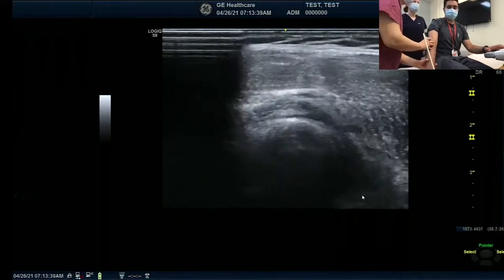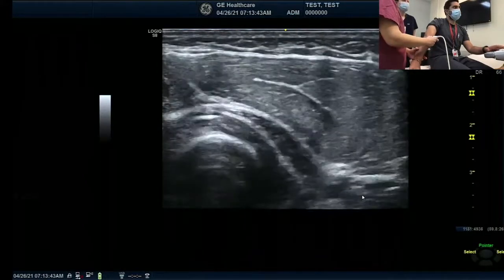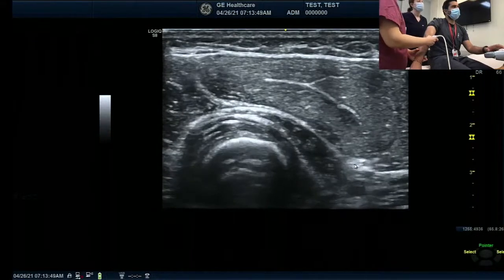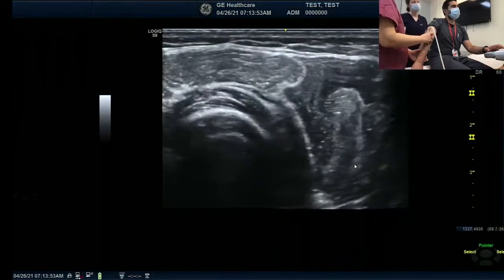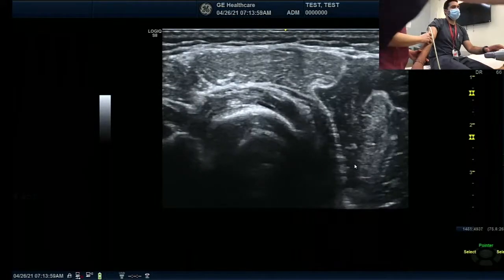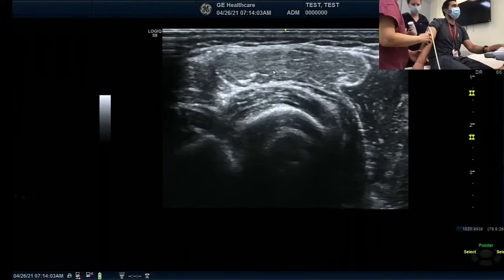Okay. So now I'm going to move the forearm posteriorly. So here, this is the extensor carpi radialis longus, supinator, and radial nerve, right? The branch. And then I'm moving to the posterior part, but distally, slowly. Do you remember I said the square shape of the muscle in the middle is going to be the EDC, extensor digitorum communis, right? Square shape.